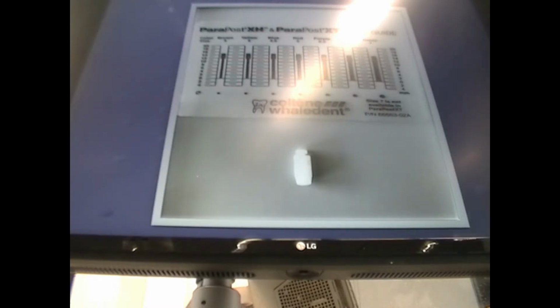Red, typically on molars and bicuspids. Okay, palatal root of maxillary bicuspid, you might use a red. It's a pretty good sized root, or distal root of a mandibular molar. Mesial root of mandibular molar, they're small, narrow, curved, and fine, and you might be using a brown or a yellow post. But again, it's size dependent.